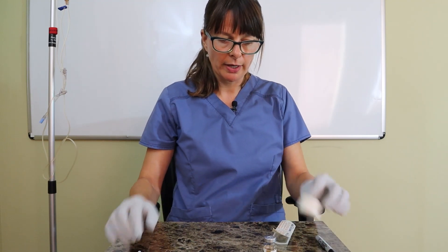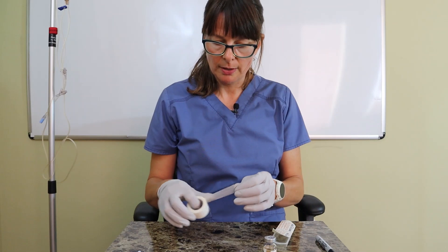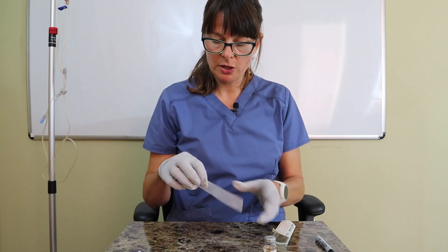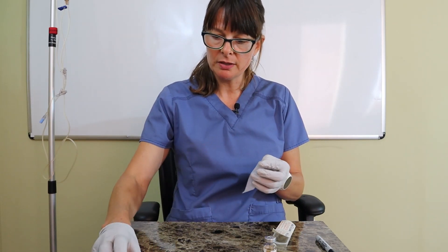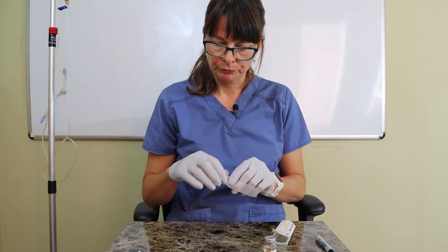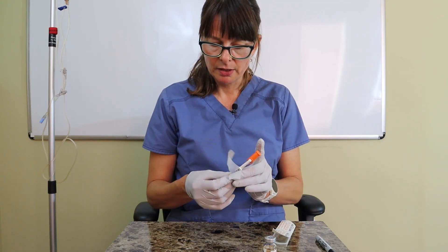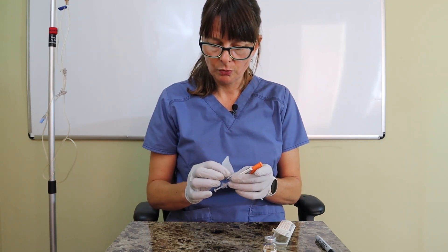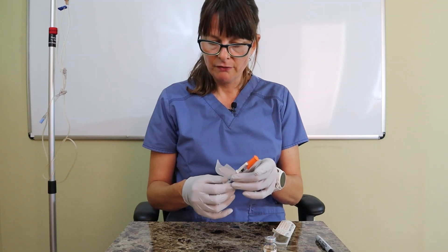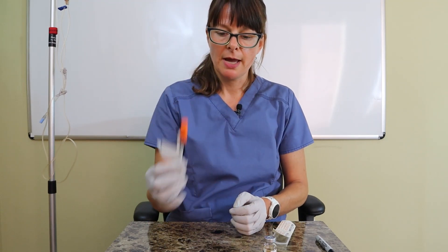Then use tape to label the syringe with what medication is inside, the time it was prepared, and the patient's information. Label it so it's easily visible and you can still see how much insulin you've drawn up. Then you're ready to go administer your medication.